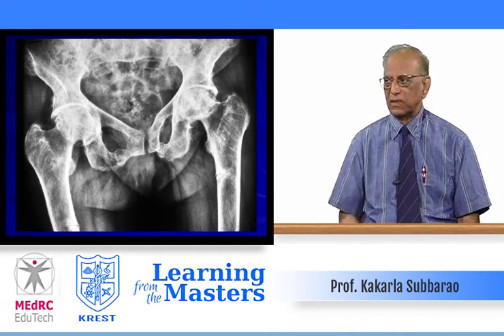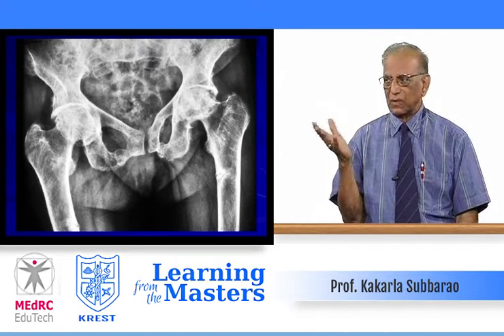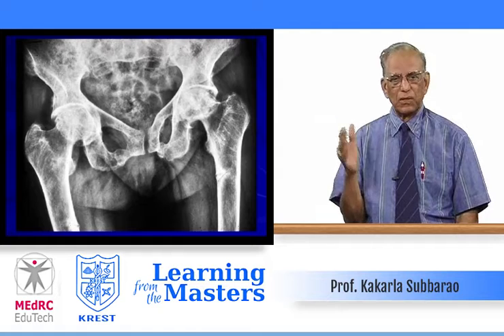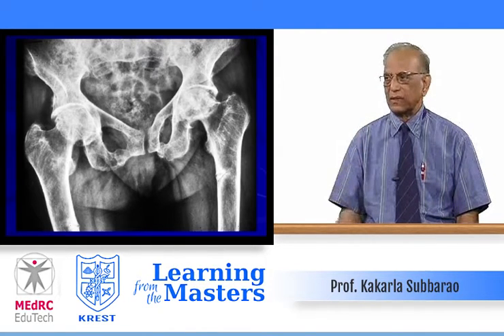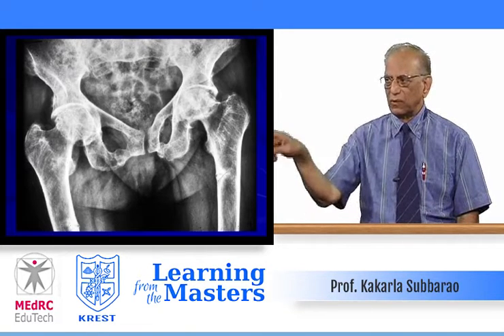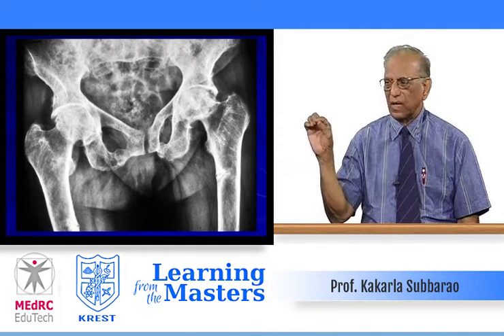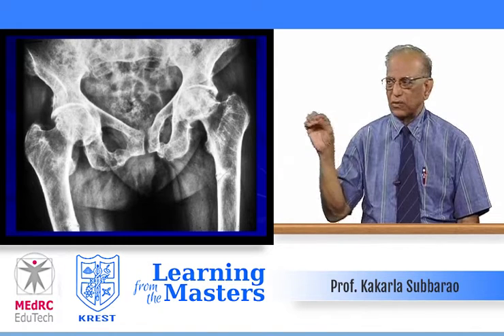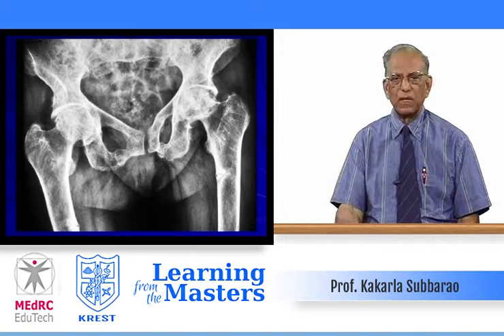In this radiograph of the pelvis in a female, there is increased density of the bones — note that increased density can also be due to radiographic technique (underexposure). Look at the deformity of the pelvis, the pubic bones, and healing fractures. In the femoral shafts bilaterally, there are Looser zones attempting to heal spontaneously, hence the increased density and exaggerated trabecular pattern. This is a typical picture of osteomalacia.